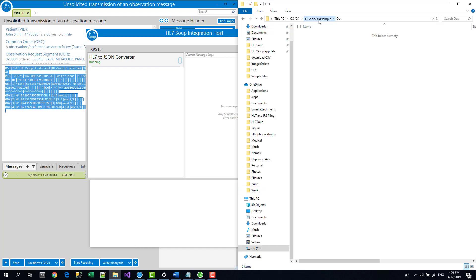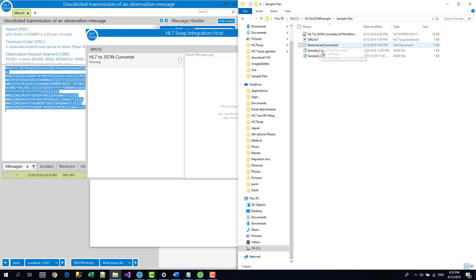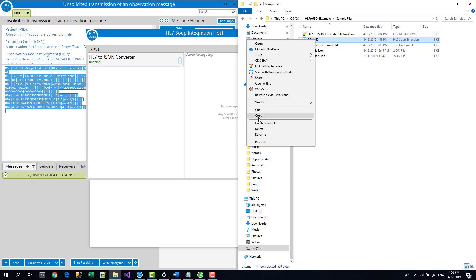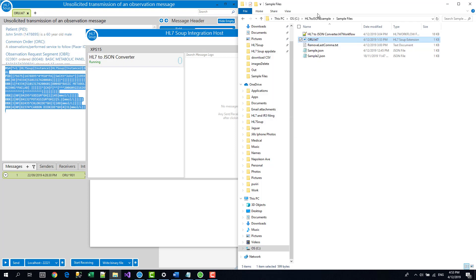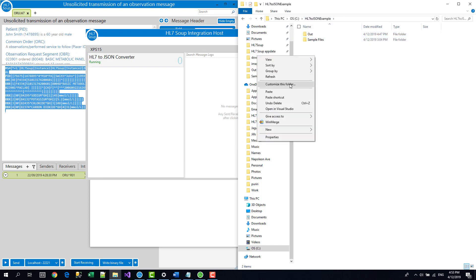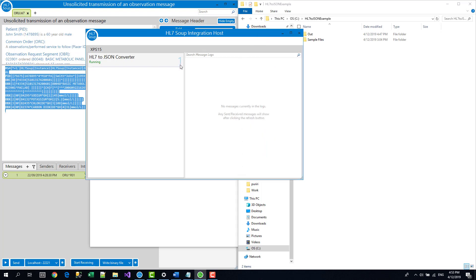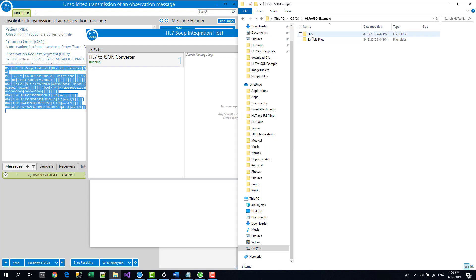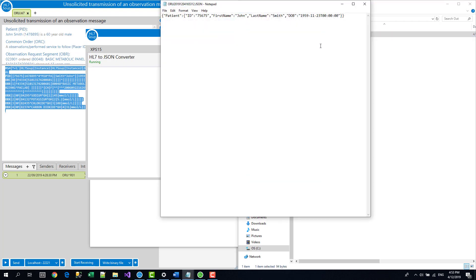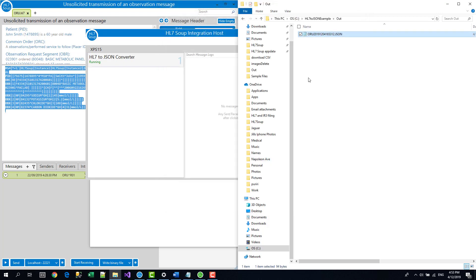So let's test it out on our very simple conversion. So I'm going to go into my example folder. I've prepared some files already. I've got the sample HL7 file just sitting here. So I'm going to copy the file and I'm just going to drop it into this directory for processing and we should see it vanish. Our system needs to catch up. There we go. You can see it's processed that one message. So if we now look in the out directory, we're hoping to see a JSON file, which is great. And I'll load that up on notepad. And you can see it's got the ID. First name is John. Last name is Smith. It's got the date of birth in the right format. So that's worked perfectly fine. Great.